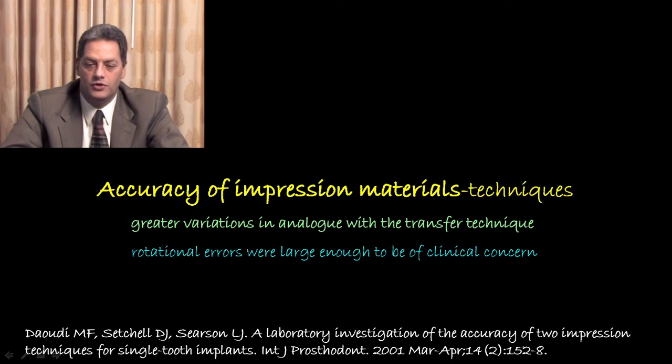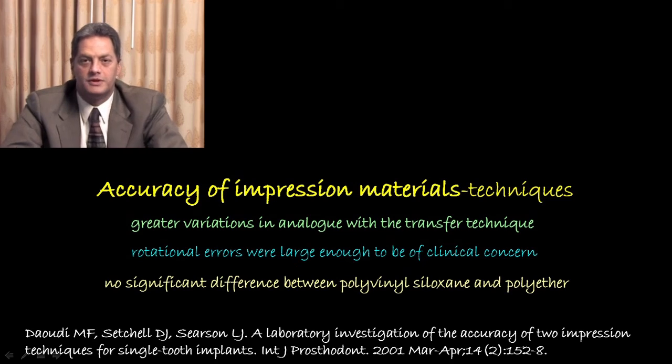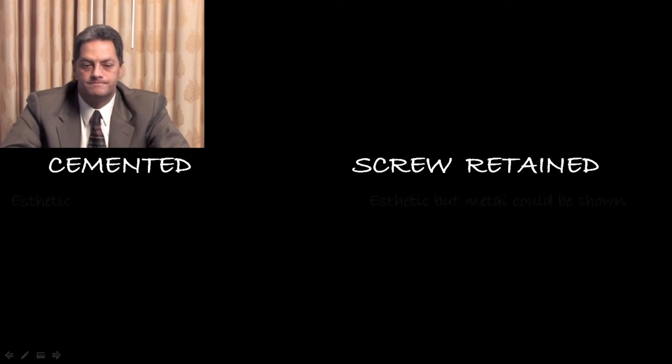So even with a single unit, I do recommend, again, to use the open tray. But they found no significant difference between the polyvinyl siloxane and the polyether material. My material of choice happens to be the polyether.